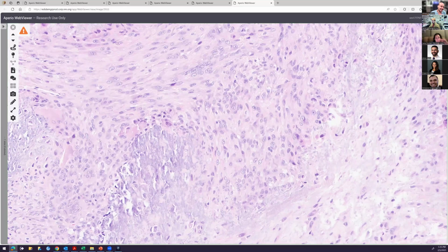I'm thinking of BPOP, but it doesn't have the blue bone. Right. BPOP is more of a bone forming lesion, right? So you think about bone. For people who are wondering what BPOP is, it's bizarre parosteal osteochondromatous proliferation. But that is more of a fibro-osseous type lesion, right? So you get bone formation, and we're not really forming any bone necessarily.